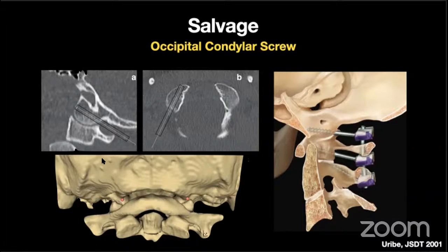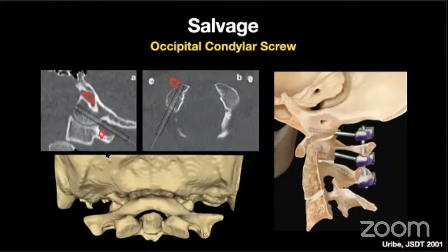You can imagine where all these are: you have the vertebral artery here, you have the internal carotid artery here, this is the hypoglossal canal, the hypoglossal nerve is here. So overall, this is quite a challenging thing to do, and I would say that without attempting this in cadavers first, or having some kind of computer navigation, to do this in a difficult situation is a hard thing. It's not caught on very well till now. The other techniques are probably an easier way to get that.